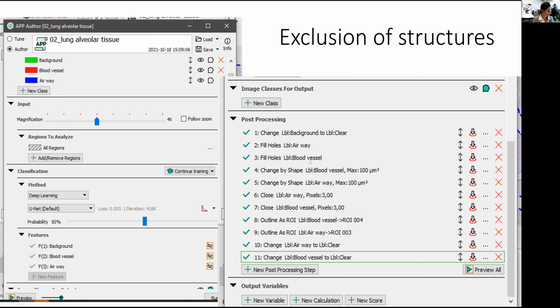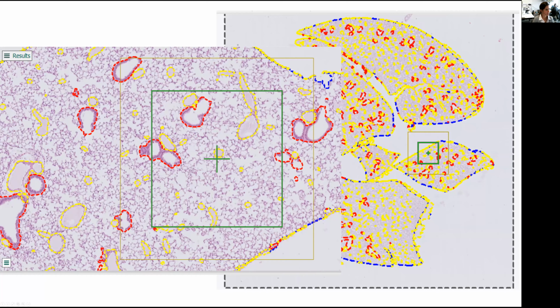So what are the things that are happening here? Again, I try to turn all the regions that I want to exclude into regions of interest that would then look like that, obviously screening the entire lung. By the way, this is the field of view that you're seeing here. So going closer, I would get a distinction between blood vessels and conducting airways. And then at a later time, I decide what I want to do with that.